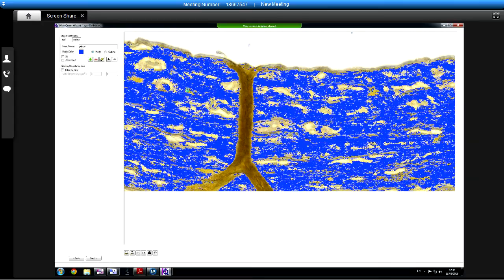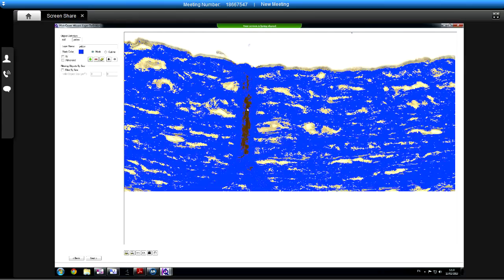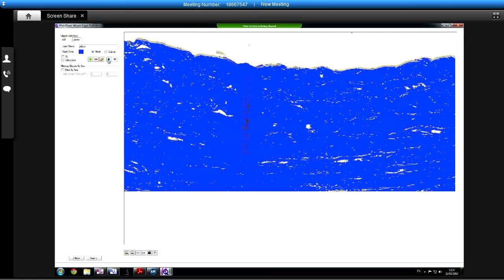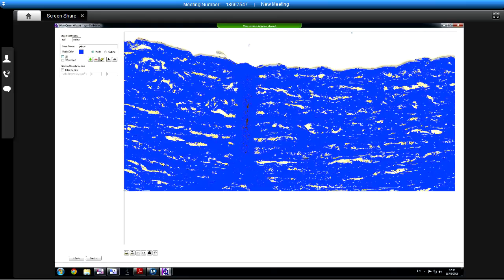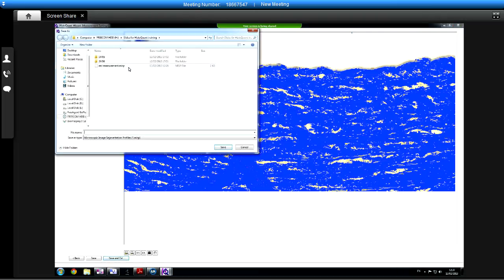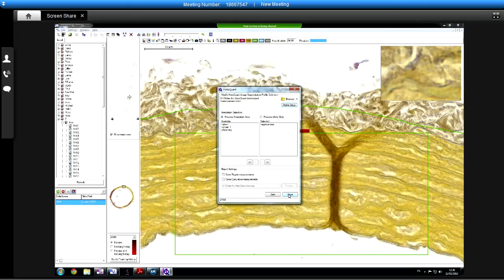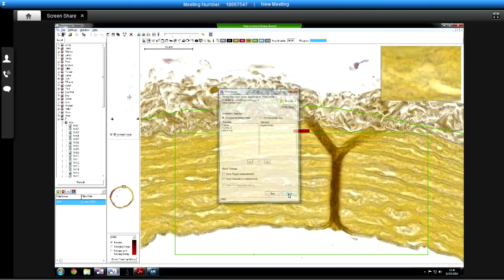I had to do a lot of scraping on these slides. It wasn't Becky's fault. It's all Arvin's fault. The GT make a right pair. It's really put on it. It just puts GT. Rather than use his proper name, let's call him that.